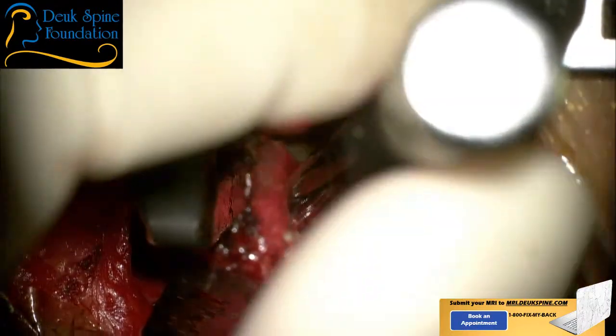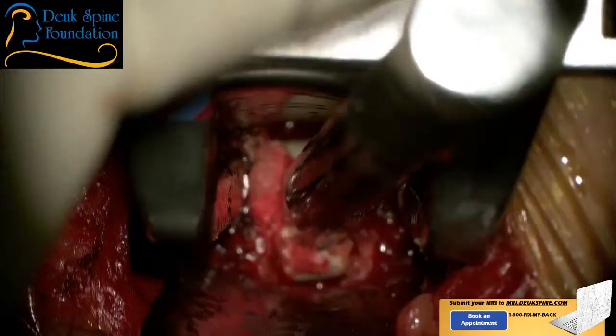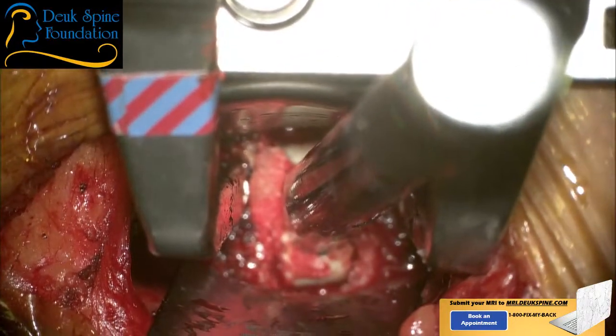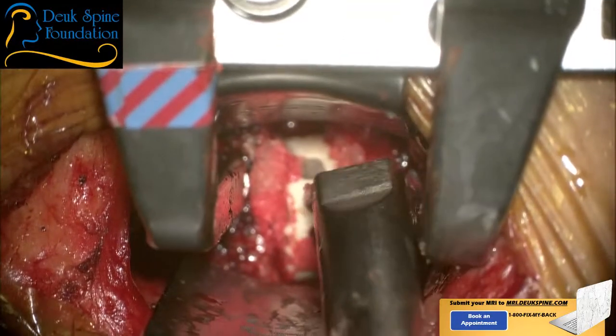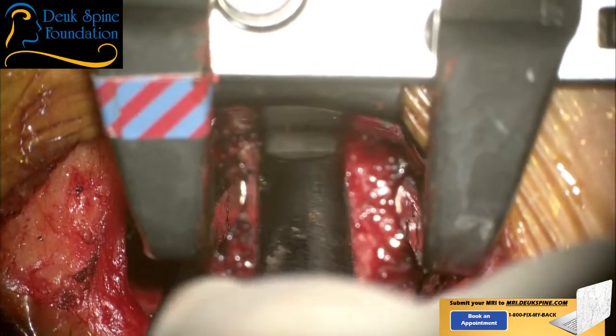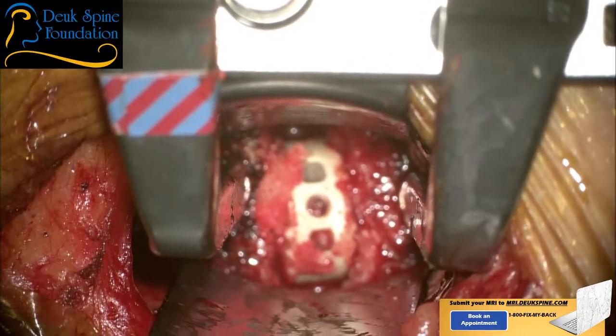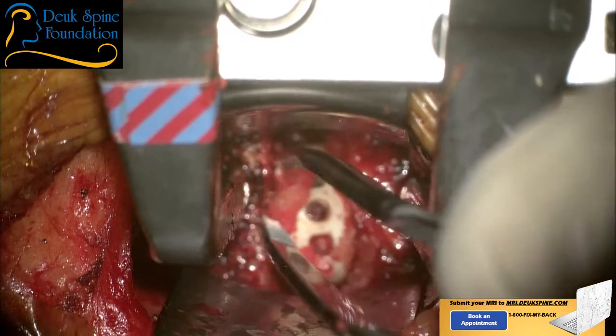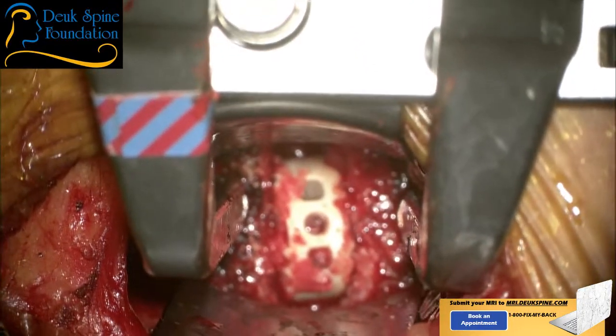What size is the plate? I want the smallest plate, as usual. All right, that's perfect. Now, some people might be tempted to use a wider cage. The problem is, the wider the cage, you can start pushing pieces of disc material or ligament or bone way over there in the corner onto the nerve root during the surgery. And then the patient will wake up with new arm pain or new arm symptoms they didn't have before. So I don't want to do that.